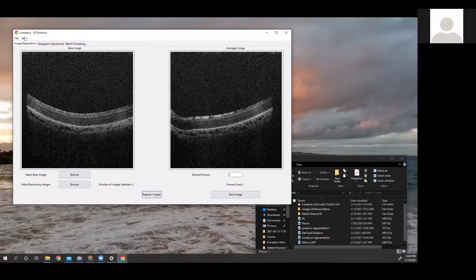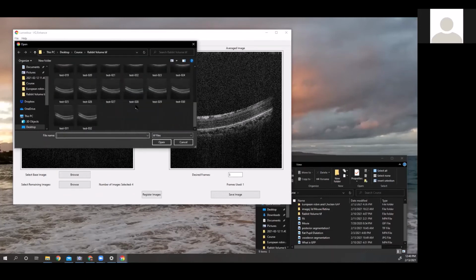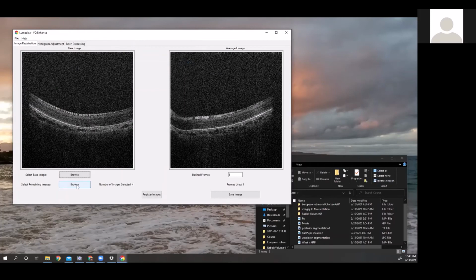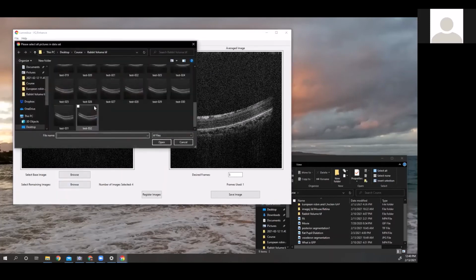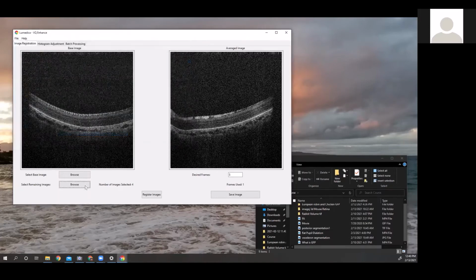This image language is different. Let's just go pick a different base. Grab a different base. Let's try that. I'm not sure what it sticks. Of course, you discover something new along the way.